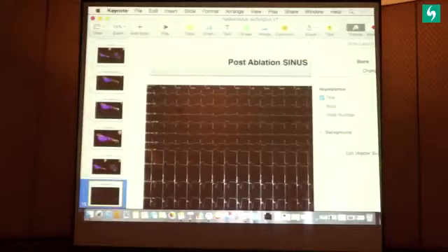This is the line all along the aneurysm of the ablation, and post-ablation the patient was in sinus rhythm, not even a single PVC. At 1 year follow-up, no discharges from the ICD. So this is one case that I could show you. So I think we can have questions and then we can finish off with the dinner.